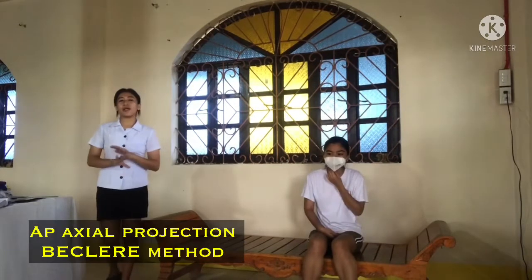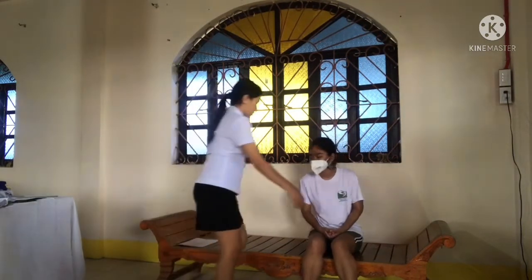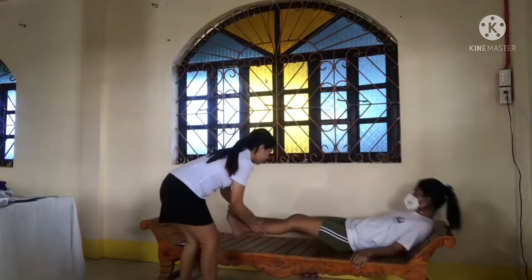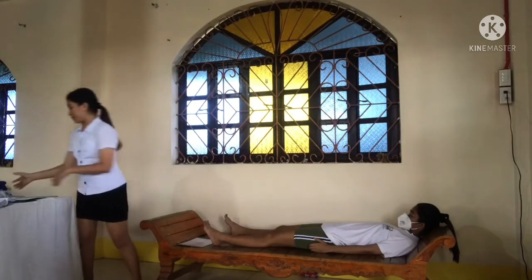So next we have the AP axial projection, Beclere method. So the IR used for this projection is 8 by 10 inches crosswise. So place the patient in supine position and adjust the body so that it is not rotated. Flex the affected knee enough to place the long axis of the femur at an angle of 60 degrees to the long axis of the tibia.